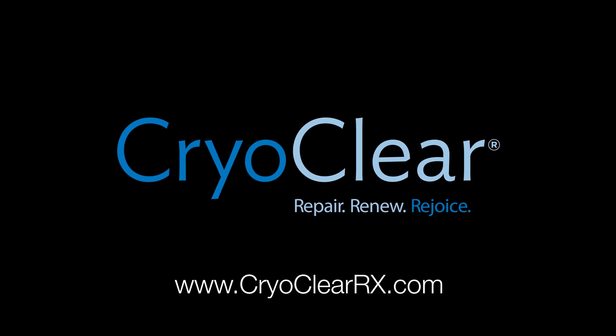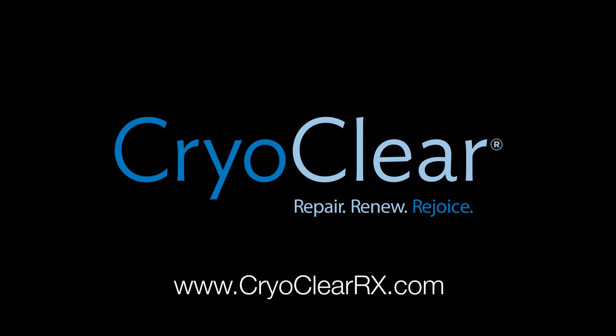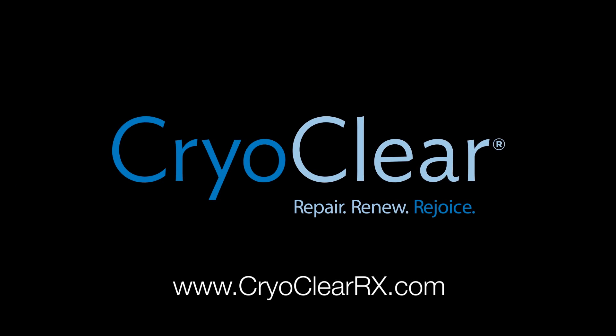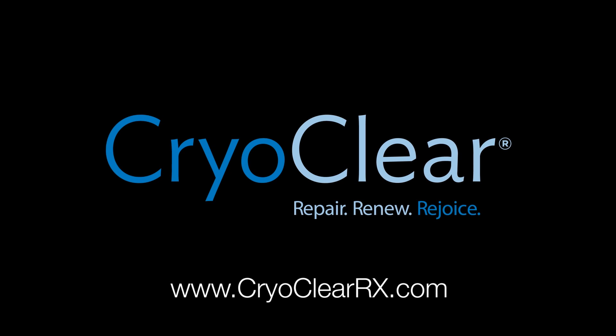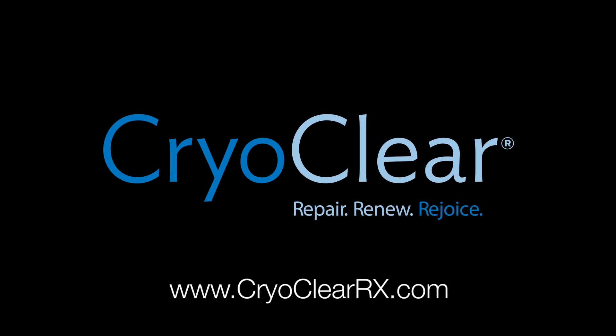CryoClear — the all-new, clearly better cryotherapy treatment developed specifically for estheticians and their clients. To learn more, please visit www.cryoclearRx.com.